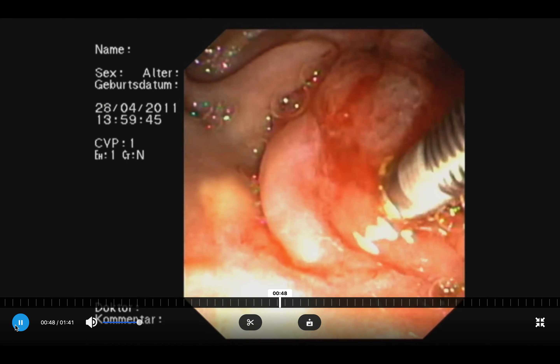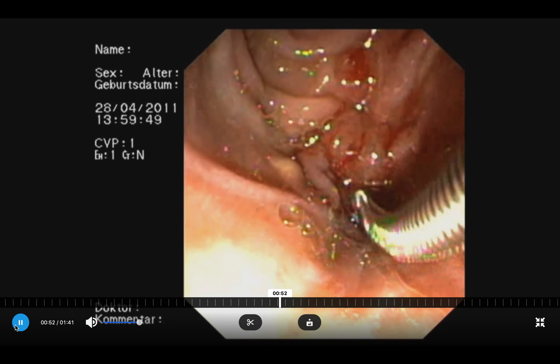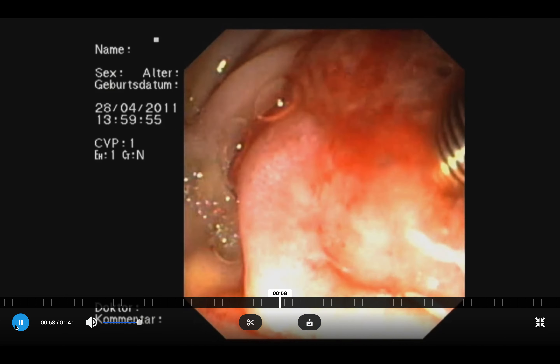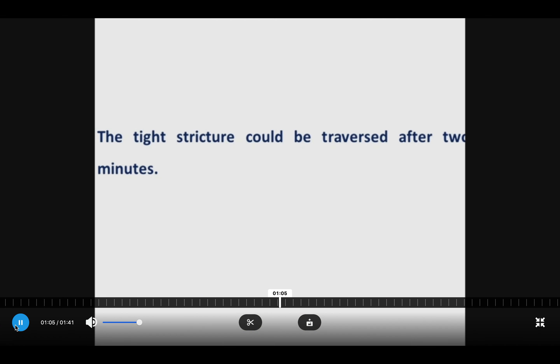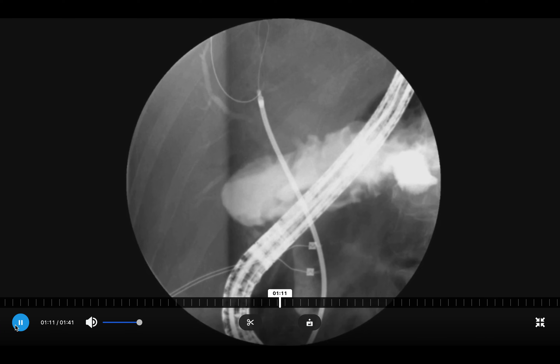The stent retriever is advanced over the wire and turned with your right hand through the endoscope. You can nicely see how this Sohendra stent retriever turns and traverses the stricture after about two minutes in this case.